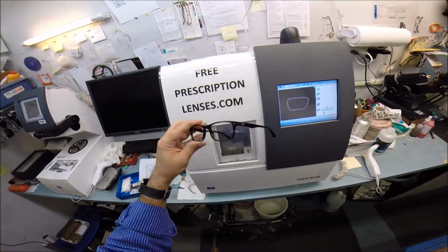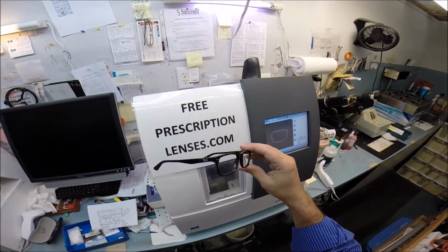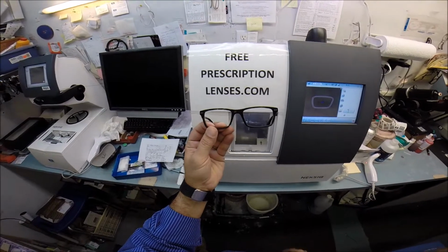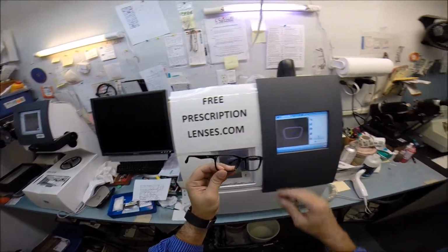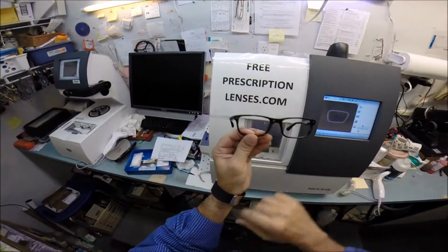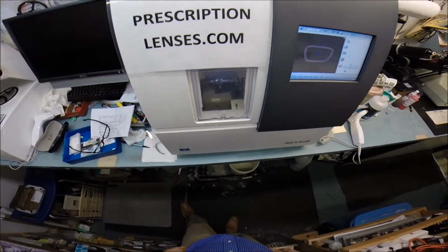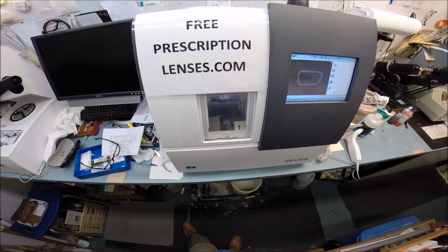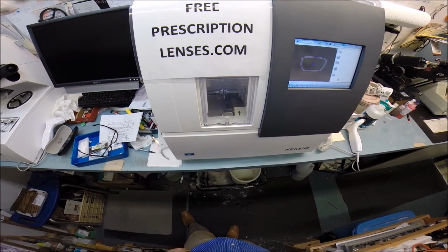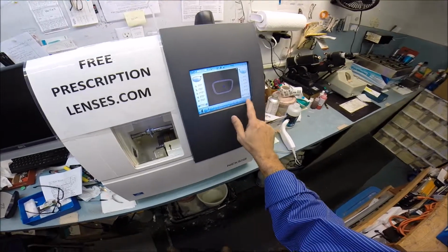The reason why I had Tyler ship me his frame this time is I sent lenses only to someone, and they mentioned they were a little bit loose. That's because I did not know the wear and tear of the frame. Someone else could have cut a large lens, and then when I come behind them years later and I cut a perfect size, it may feel a little loose. So that's why I asked Tyler to mail me his frame, just so I could do a perfect fit. If I had not gotten an email from someone saying they thought they were a little bit loose when they mounted them, first time that's ever happened, but I apologize, Taylor.